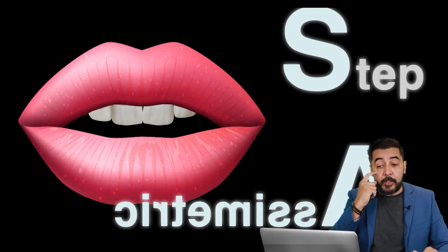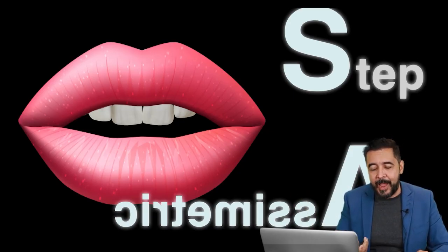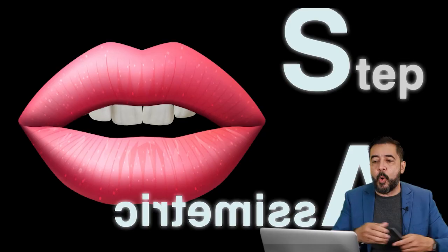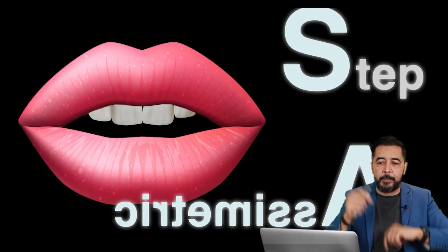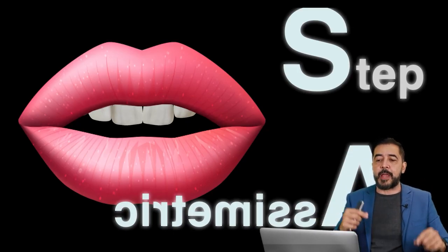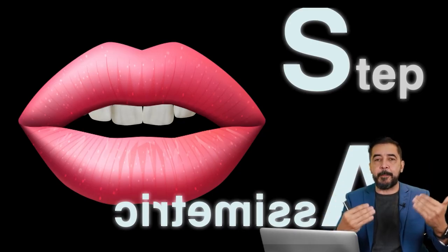But there is something that none of my patients would like, which is an asymmetric step. When you have an asymmetric step, due to our own errors, due to our own mistakes in the beginning of our treatment, just putting the brackets in different positions, sometimes we build these asymmetric steps.